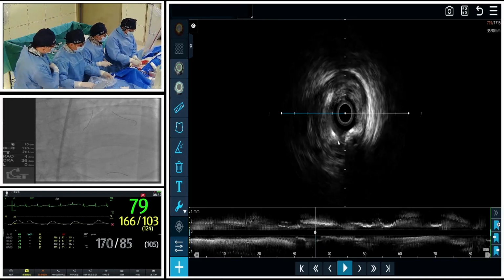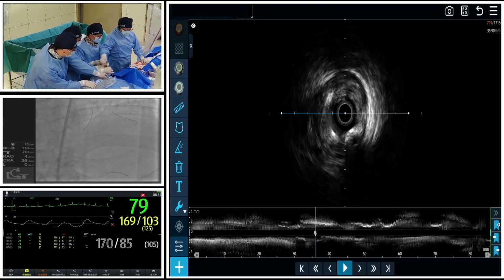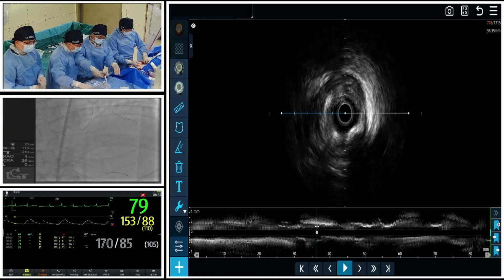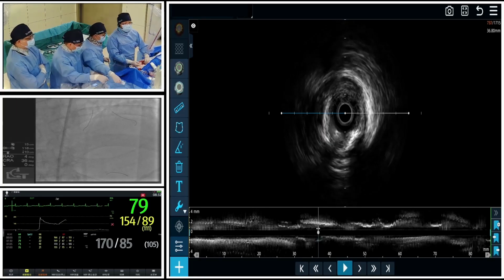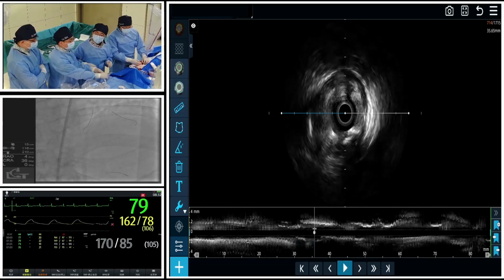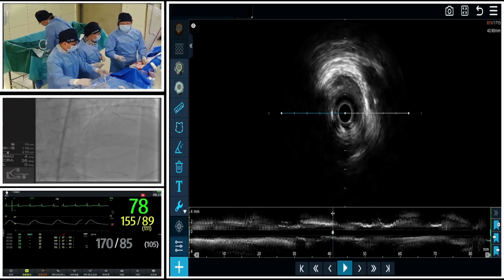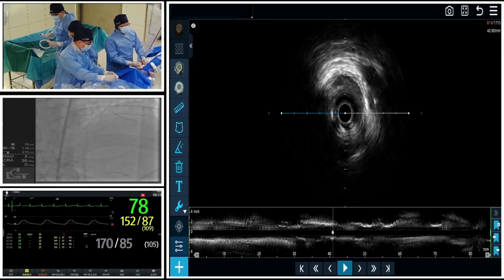Okay, here we can see a very typical fracture of the superficial calcification. This site is also the most severe site of calcification, just like the demonstration of our intelligent 3D reconstruction system. This is the 2.75 balloon, in the proximal part of the LAD, and we can see a very typical superficial calcification on the surface. And here 1.5 is balloon, another demonstration of the calcium fracture.